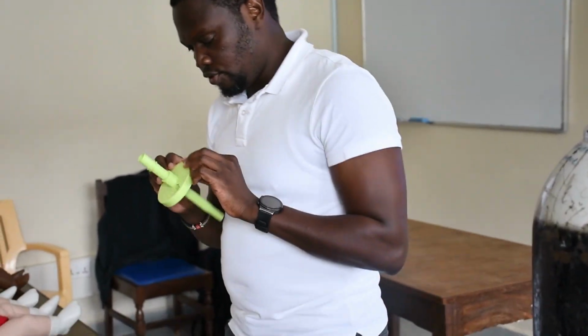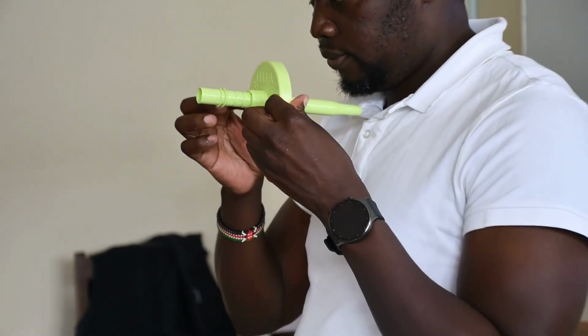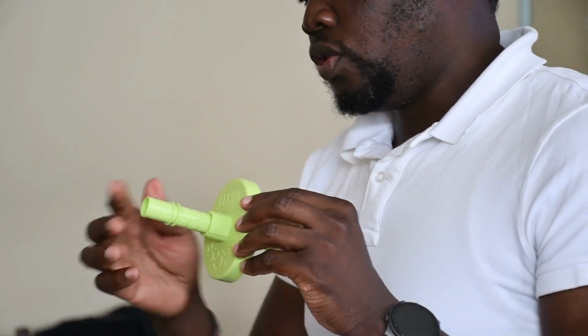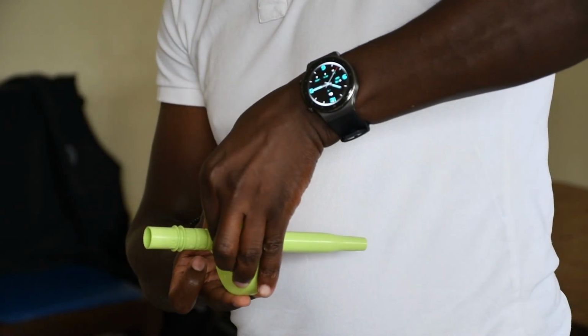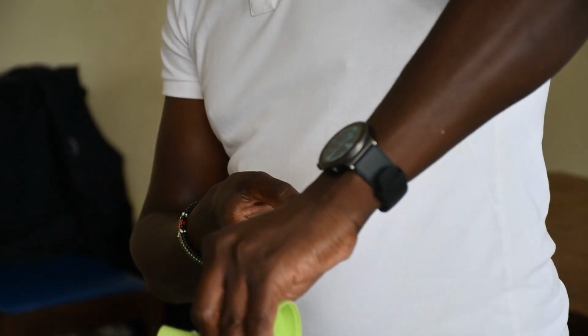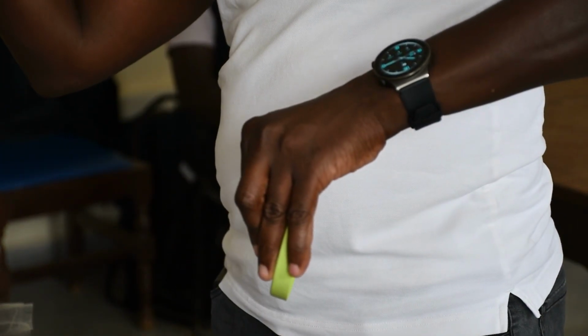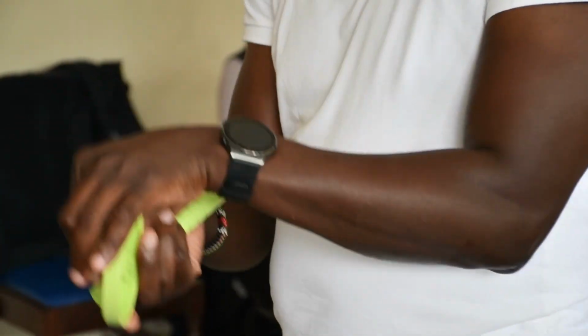So to adjust this probe, this one, you have these arrows. Okay. So these arrows are less than a point. Yeah? So to adjust this, what we want you to do is, when you use the arrows, put your finger up and squeeze inside. Okay? When you squeeze inside, you unlock the system. So this comes out. Okay? When you want to make an adjustment, always, you have to squeeze this point.